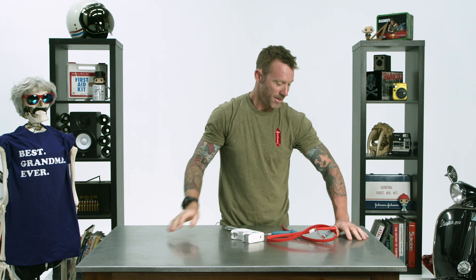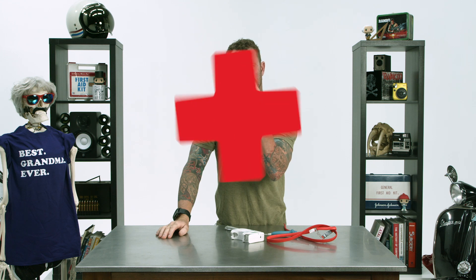And this thing hurts. That's nice — that's real nice. All that blood coming back.